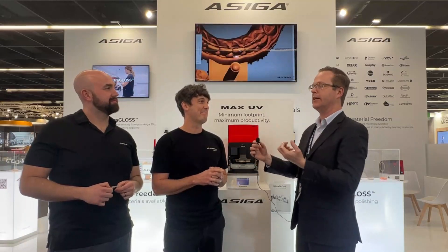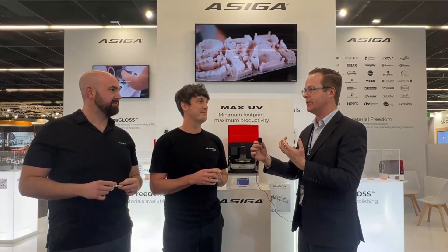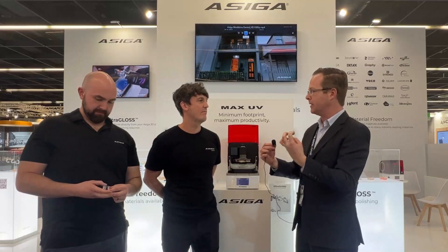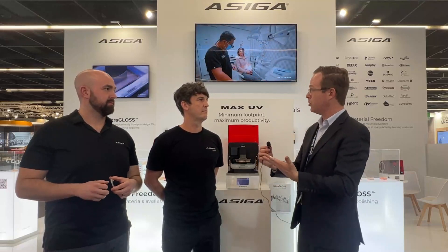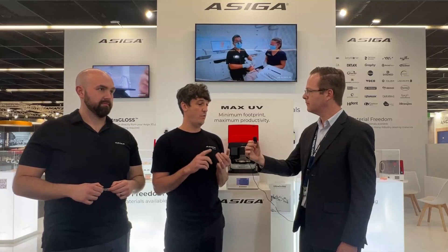You use the same materials as you normally would — wash and cure exactly the same — but they come out with a glossy finish. I print a lot of occlusal guards and having to polish them drives me crazy. I've used rag wheels, pumice, special solutions, and compounds. So if I'm printing now with the new tray, do I still follow those protocols? The only thing you will not need to do is the polishing process. You still follow the material manufacturer's guidelines for washing and curing as normal, but at the end you're left with a polished finish.